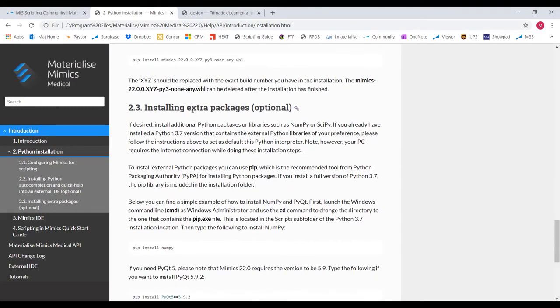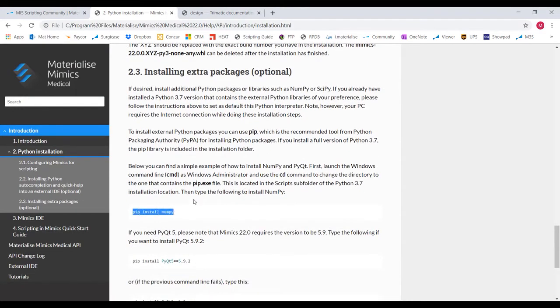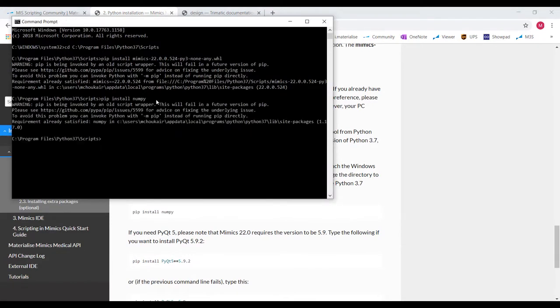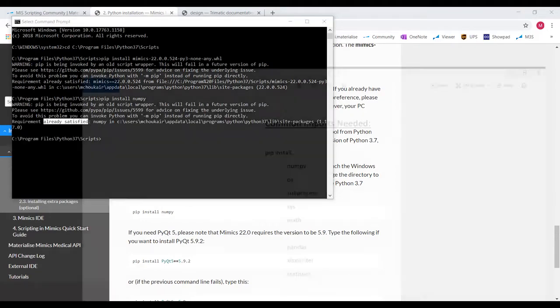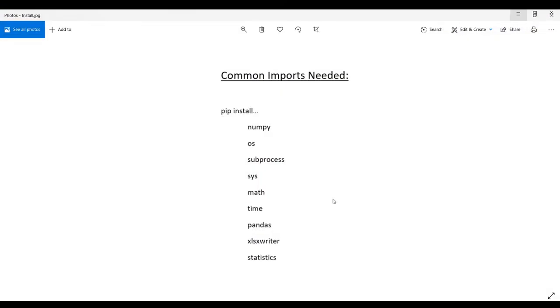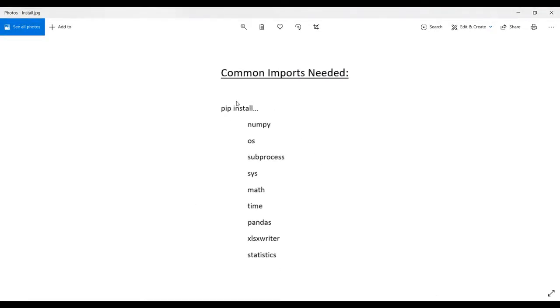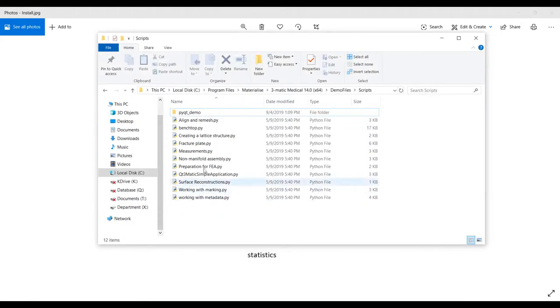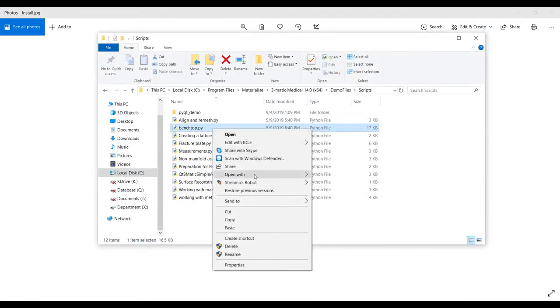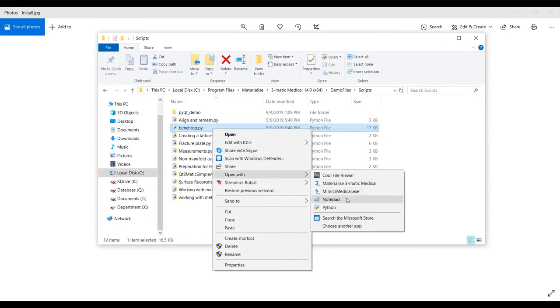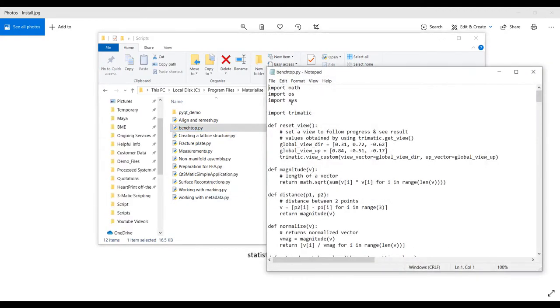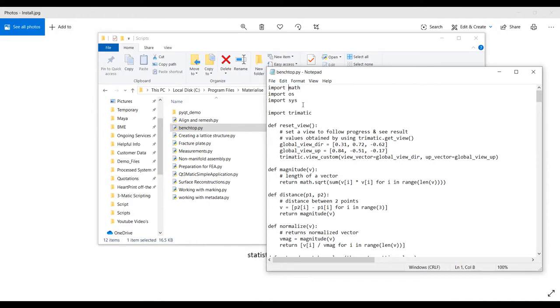Next, we're going to want to import the rest of the packages like numpy. So again, pip install and then numpy and hit enter. Here are a few of the most common imports you'll potentially use during your script. So go ahead and install all of these in the same way. Of course, there are a bunch of other packages and you will know what you need at the top of every script. So let's say I want to use this benchtop script. I need to make sure I have all these installed before I can use it.